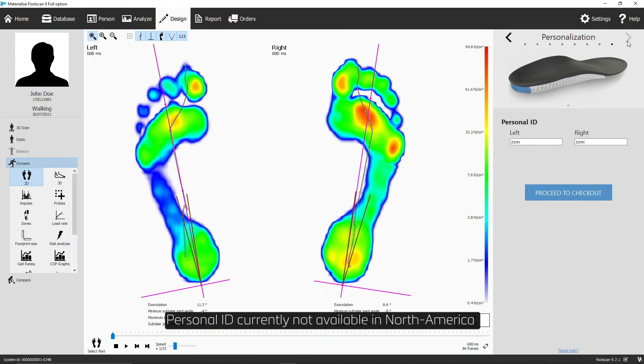Select the personal ID, which will be printed on the back of the heel cap, and click Proceed to checkout to finalize the ordering process.